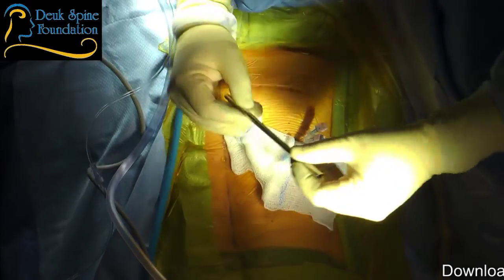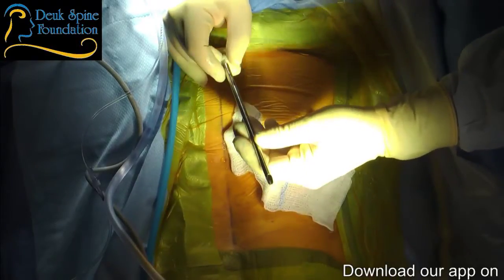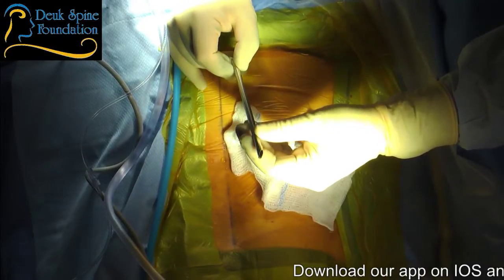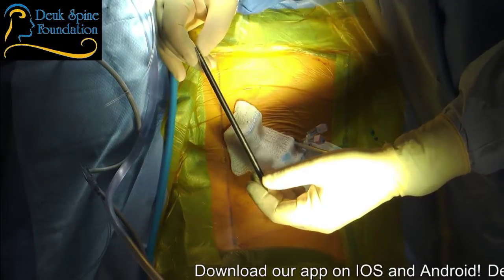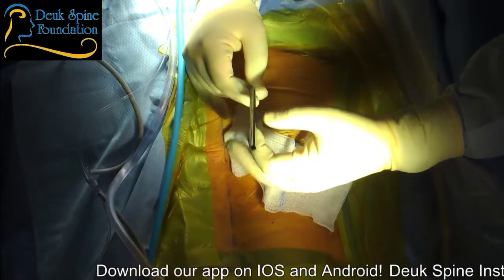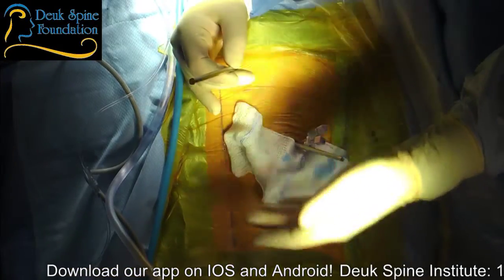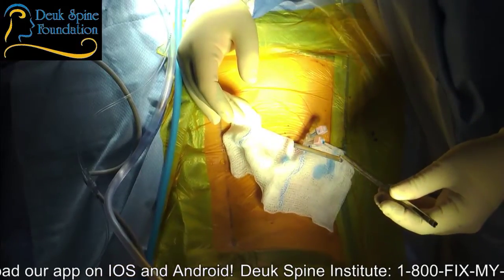This is a tubular retractor. Can you see this here, Sean? Yes, we can. So the whole surgery will be done through this tube. Okay, this is all FDA approved stuff. And the outer diameter of this tube is 7 millimeters. So that's why the incision can be so small, because I do the entire surgery through this tube.